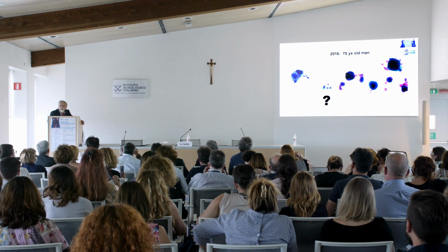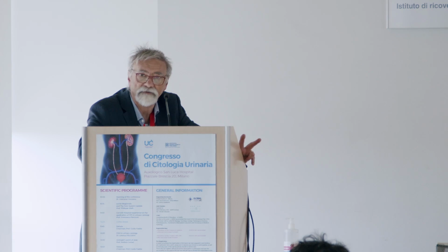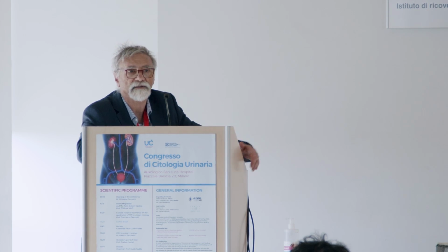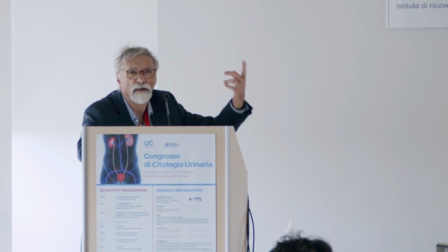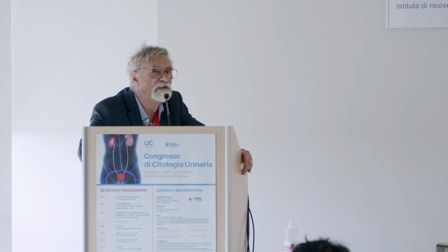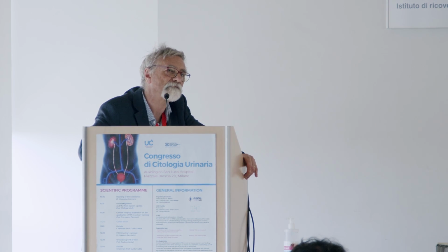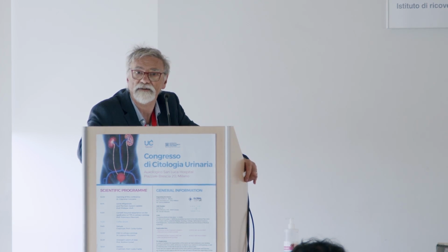First question. Usually, urinary cytology is done on 3 samples. All showed 5 to 7 cells. Do I consider it suspicious, or do I consider the whole group of samples and make the diagnosis positive for high grade? Your opinion?